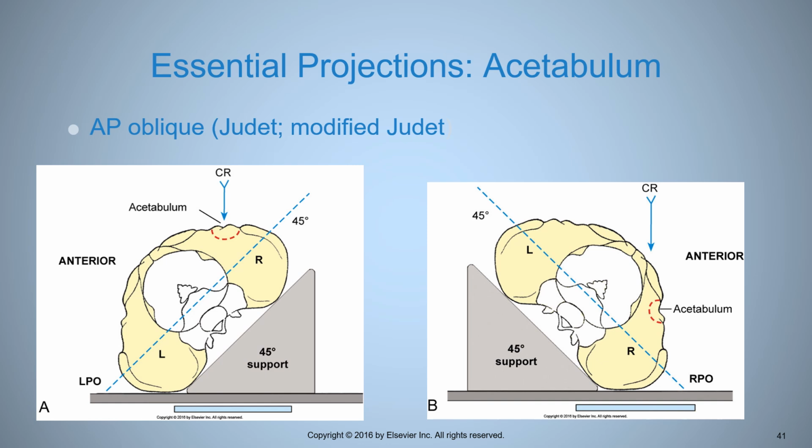Now it might be that they're just having problems with one of their hips, and so you could get a unilateral Judet view series, but I've never seen a radiologist do that. I only shot it once. It was at Vanderbilt, and it was a bilateral. The book describes the setup for a unilateral with a 10 by 12 field. I'm telling you, in clinical practice, you can save radiation and only do 2 exposures instead of 4 if you just use a 14 by 17 crosswise and get both the internally rotated elevated side and externally rotated non-elevated side in the same exposure field. And so you'll modify your centering directions. If you're doing bilateral, center straight at the pubic symphysis. If you're doing unilateral, center right at the femoral head.